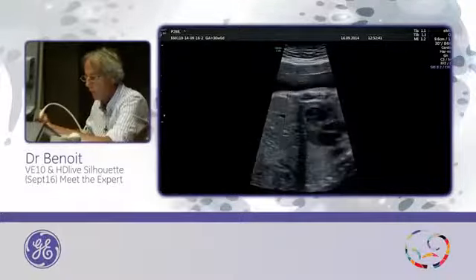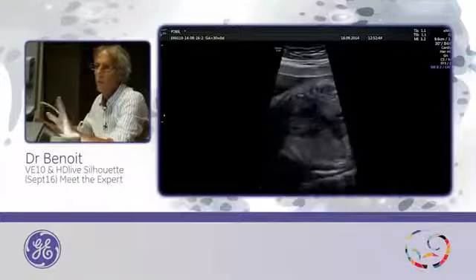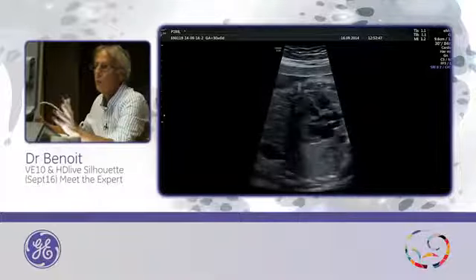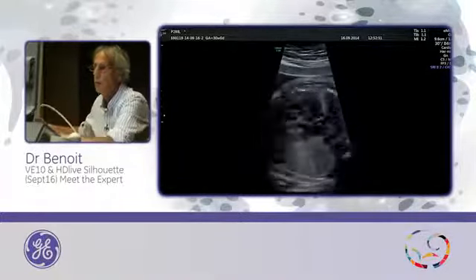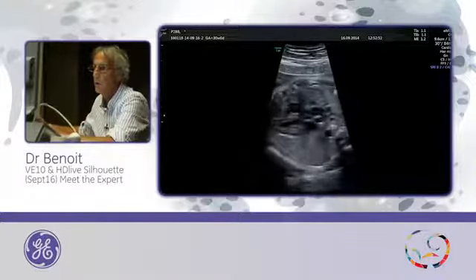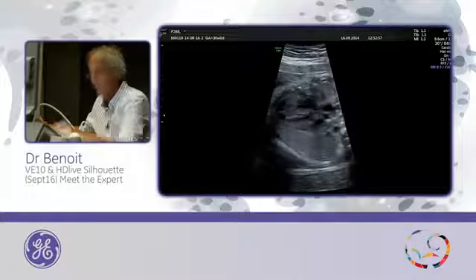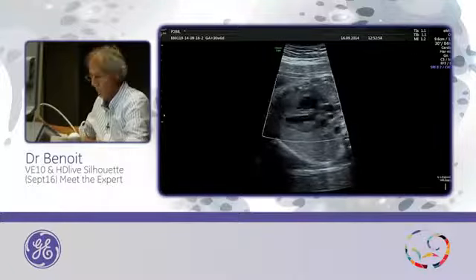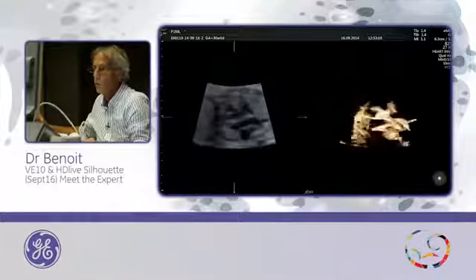But this works fine when you are quite late in the pregnancy. This is okay because it's 30 weeks, but if you try to do it at 18 weeks, it will not work because the heart is too small. But I will do it again, so start from here, 4D, and the great arteries.